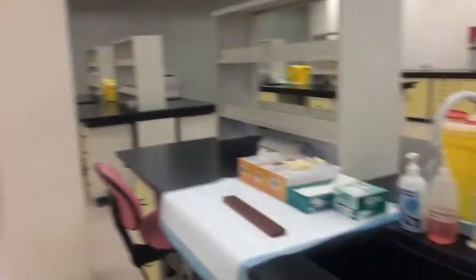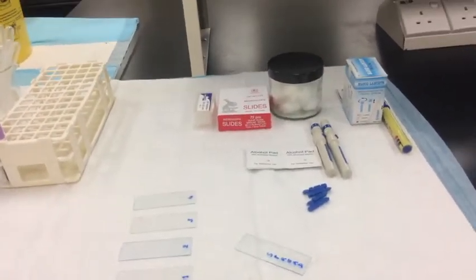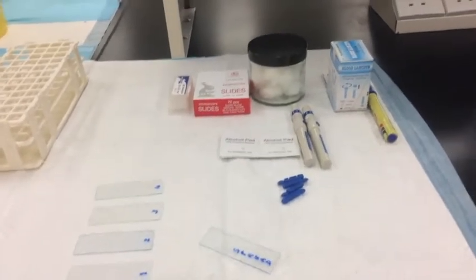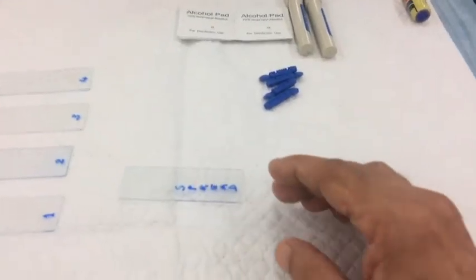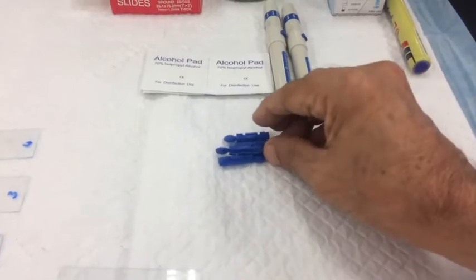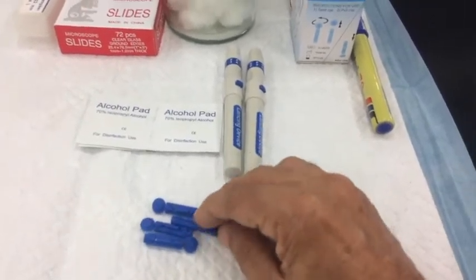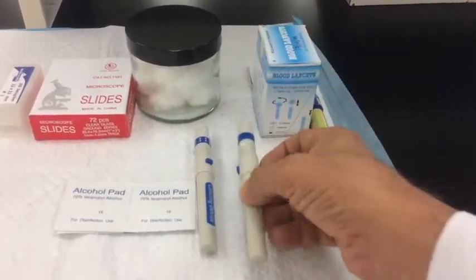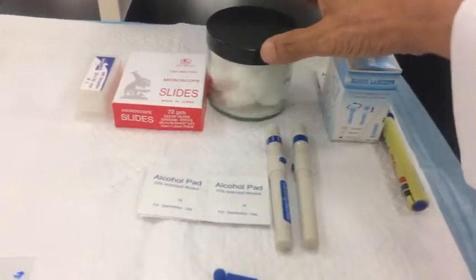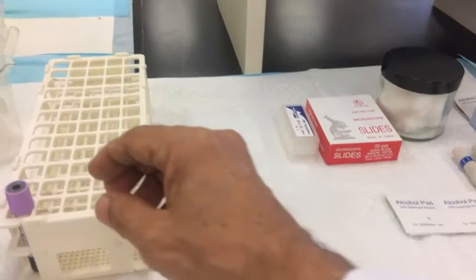We will need certain materials for this whole preparation. We need a set of glass slides numbered one through four, another slide called a spreader slide, alcohol swabs, and a sterile lancet — you can also use an injectable type which is more limiting.